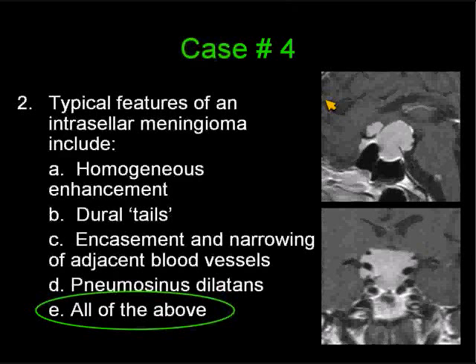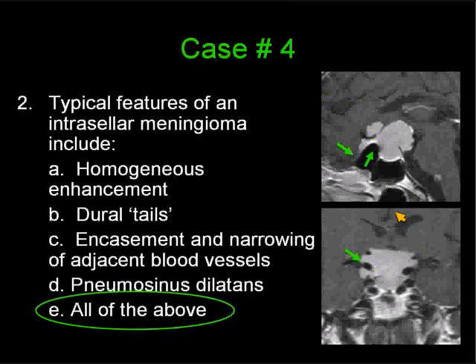Let's look at the findings. In this case, we have homogeneous enhancement on the sagittal and coronal image. We have a dural tail anteriorly and probably one posteriorly. We have encasement of the blood vessels — you can see them surrounding the blood vessels bilaterally. This dark linear area was actually a blood vessel in this patient.